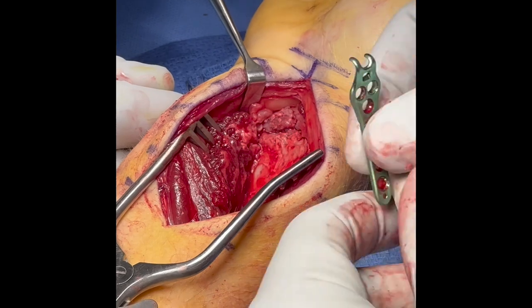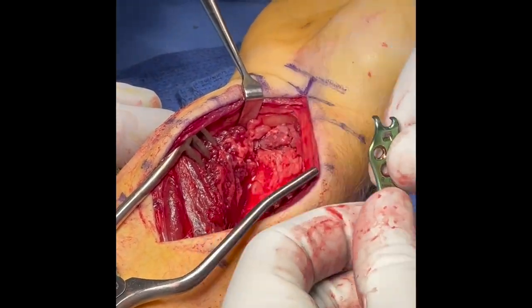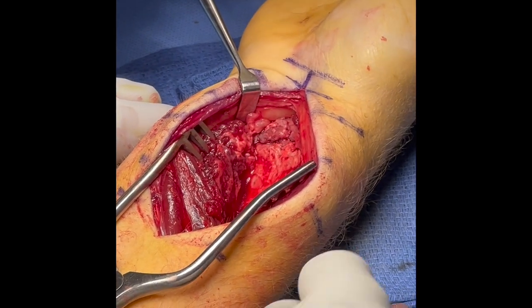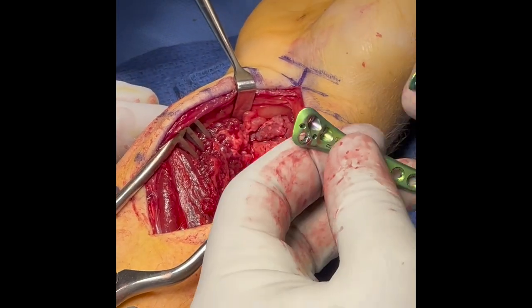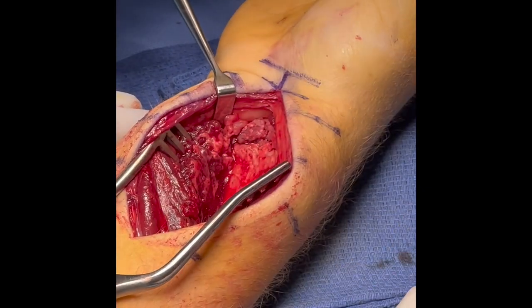To stabilize this fracture, the NuClip dual-plate fixation system was utilized. This has a separate hook plate for the lunate facet and two different plates — small or wide — for the radial styloid fragment.